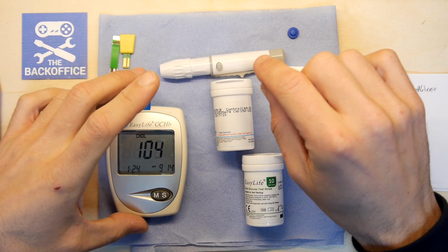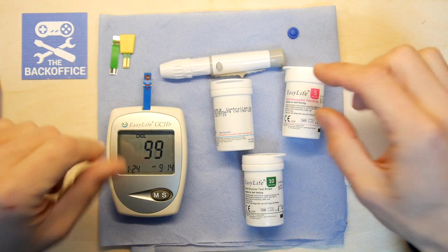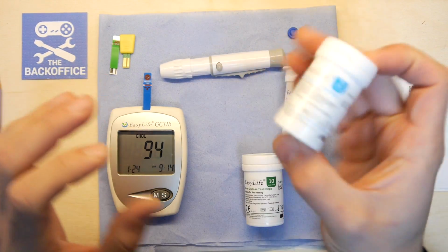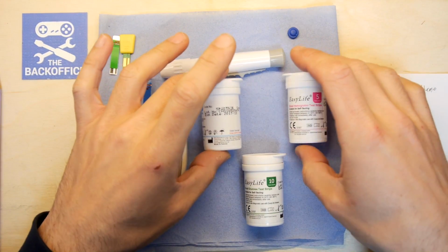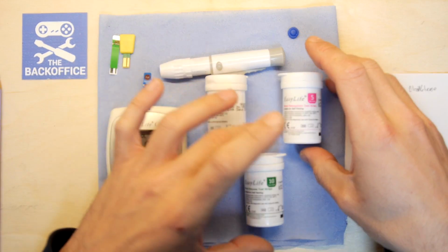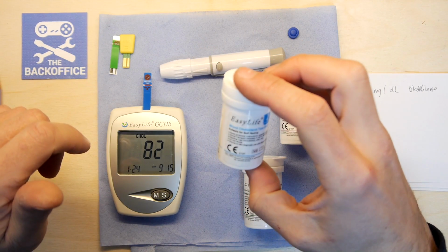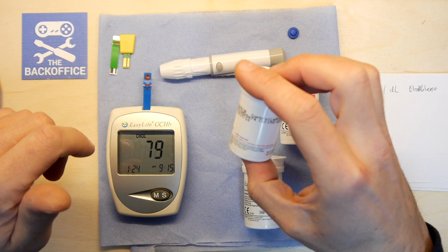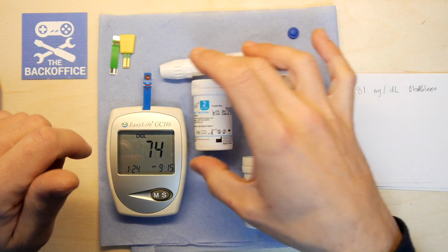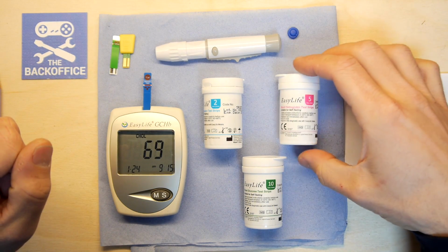I was just thinking really that these tests are all well and good as long as you keep up to date with the strips, because the strips say use within 2 months after opening, and I suspect the machines know when they're going to die. So if you're going to get one and do some tests, do all the tests right away that you want to do, and then maybe just follow them up at whatever the interval is. So if it's 2 cholesterol test strips and they last, let's see what it says. Use within 2 months. Make those changes to your lifestyle and then take a second reading 2 months later and see if you're better or worse. Make use of those results.